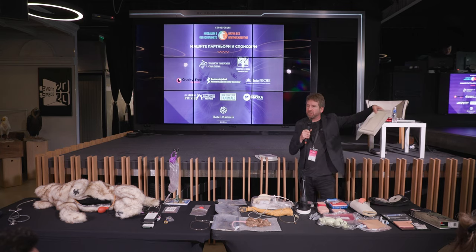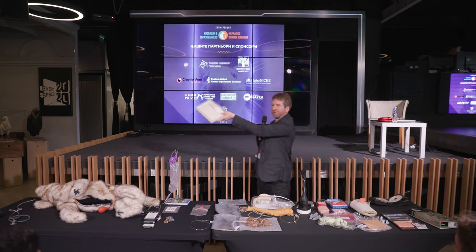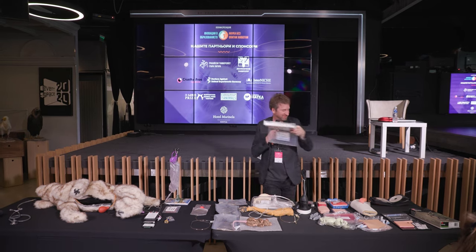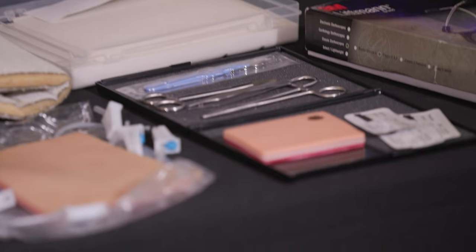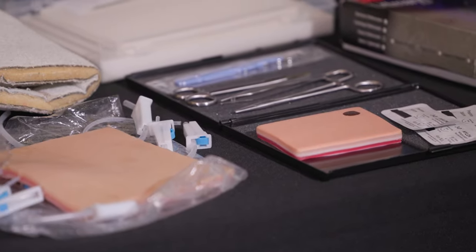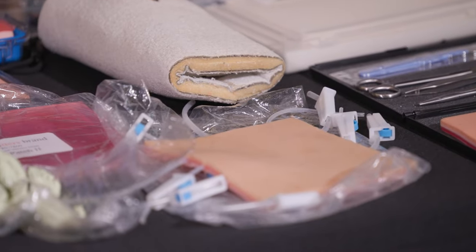These can be made from silicone, rubber, or other materials. There are also particular organs — this is some bowel. You can practice how to handle this and work with different instruments and to suture.